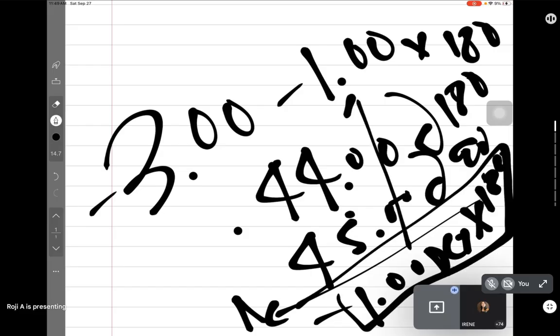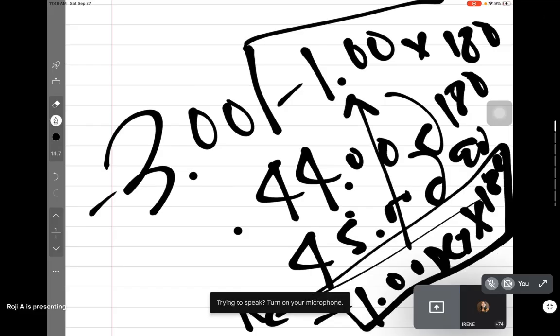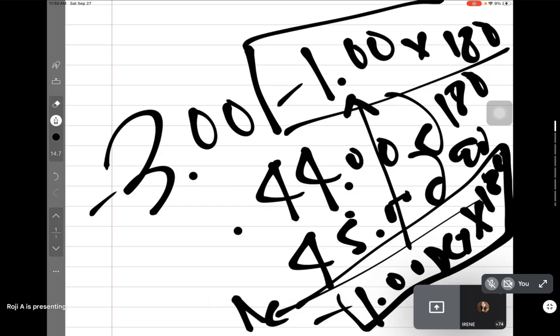You correlate this here. What can you say? It's the same. Very good. Once it's the same, your description now is the astigmatism of the patient is purely external.